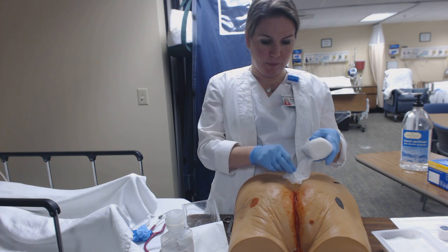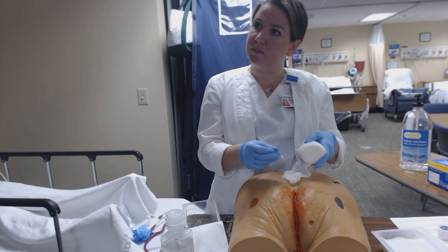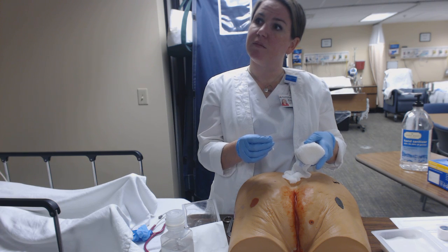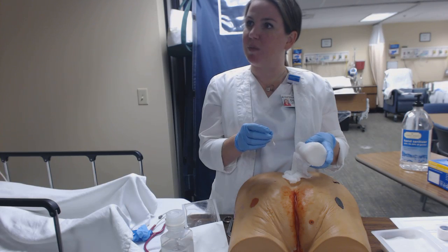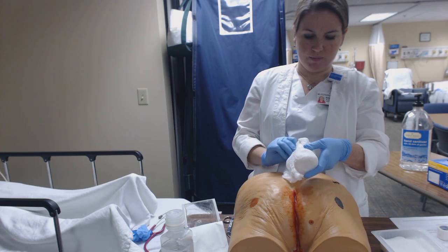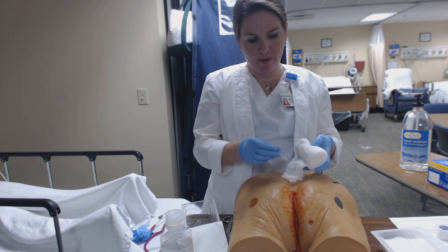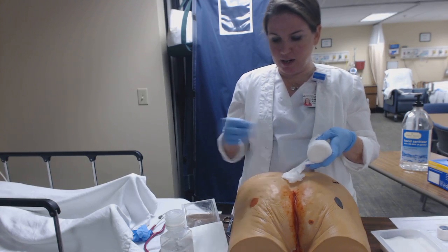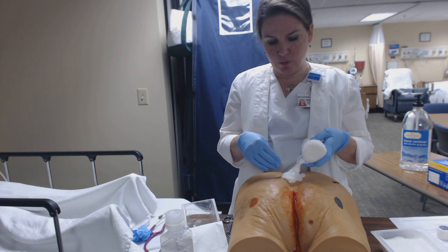I think it would be nice to ask the students why we have to put the packing back into a tunneling open. So I think they should think about that. What do you think, Miss Canby? I think that is a great question. Like, what's the reason? We always like to know why we're doing what we're doing. Yes, and not just because the doctor said so. Right. Okay. So I've got plenty of packing here. I wanted to make sure it's all touching all of the wound bed there.